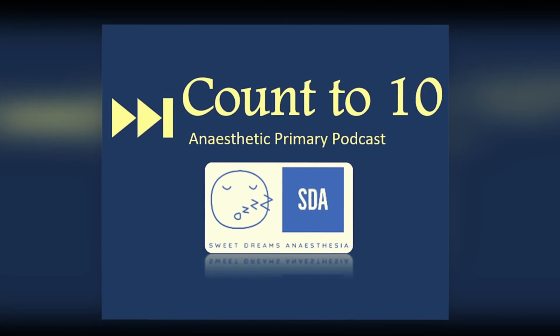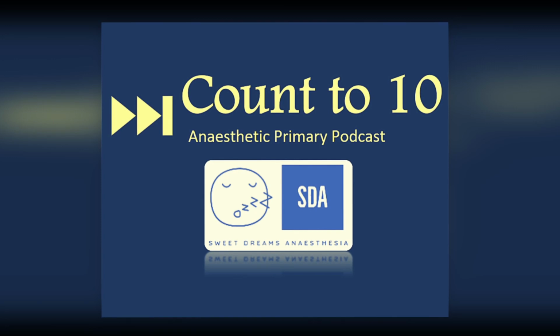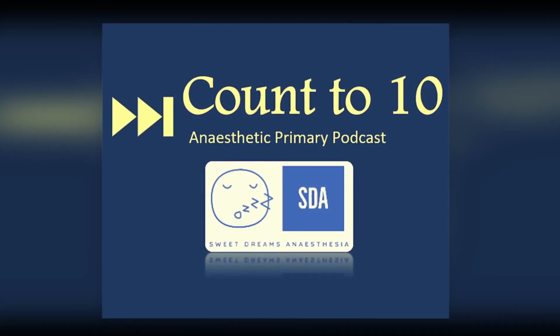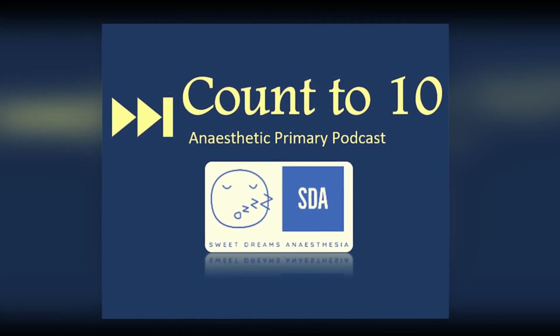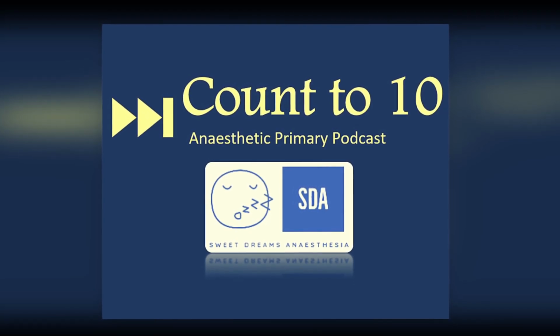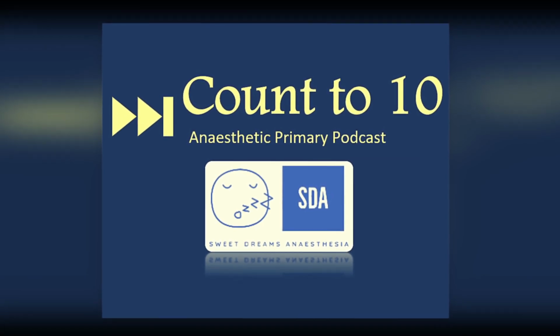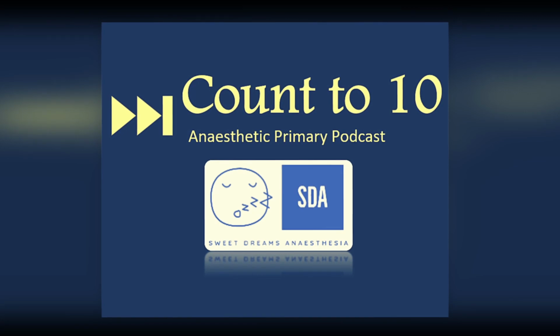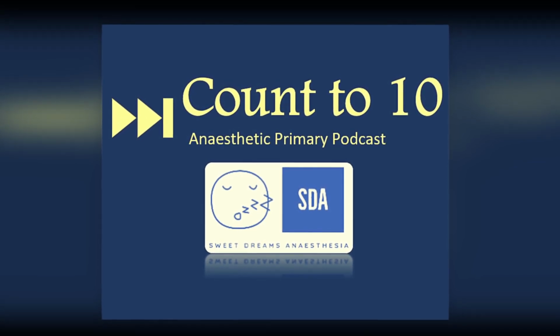Common weird questions you might get asked about with the pulse oximeter are why do we place it on a patient's finger? If you think about this logically, it's not hard. It just needs to be in a place where there can be some degree of transparency so that light that's emitted by the diode can be captured by the photodetector. So typically these are places like your fingers, your toes, your ears, and your nose. Any other place which is more solid, the light will be completely absorbed, so the photodetector will not have anything to compare the oxyhemoglobin absorbance from the deoxyhemoglobin absorbance.